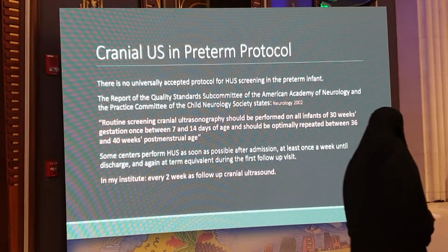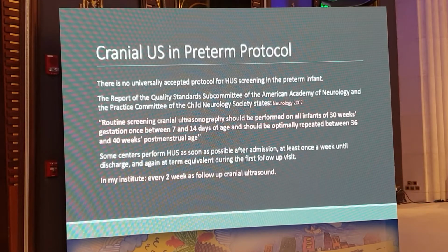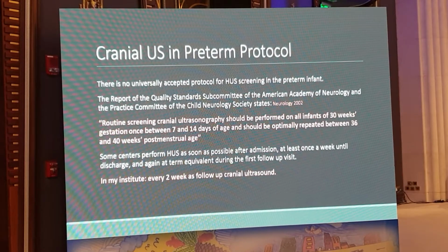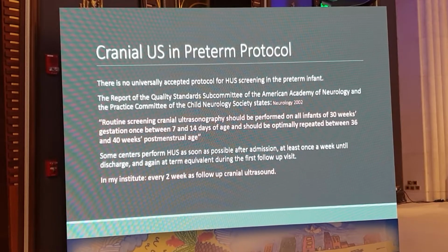Cranial ultrasound in the preterm. There's no universally accepted protocol for screening head ultrasound in the preterm. The only report that I found was from 2002, and it said routine screening cranial ultrasonography should be performed on all infants of 30 weeks gestation or less once between 7 and 14 days of age, and should be optimally repeated between 36 and 40 weeks post-menstrual age.